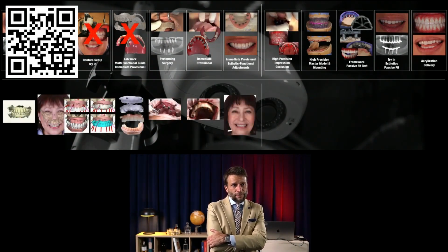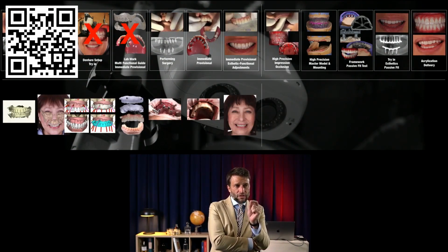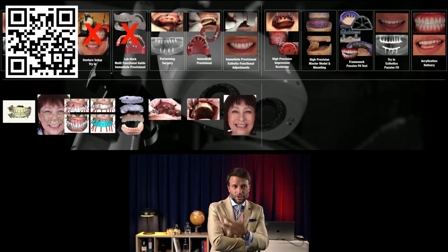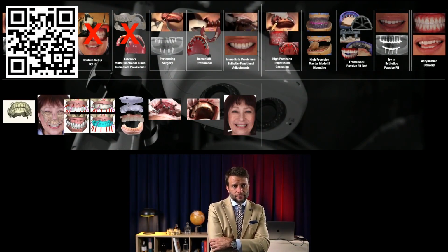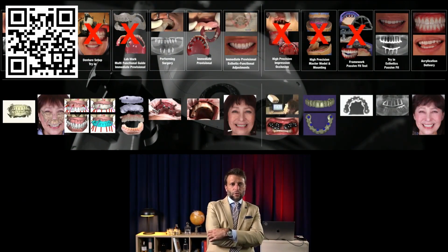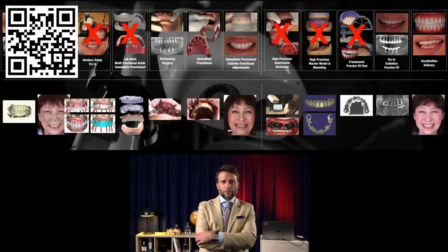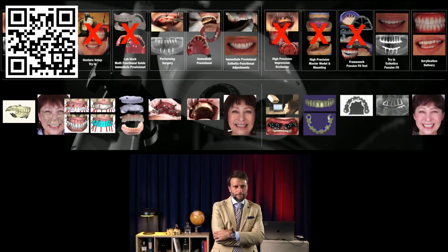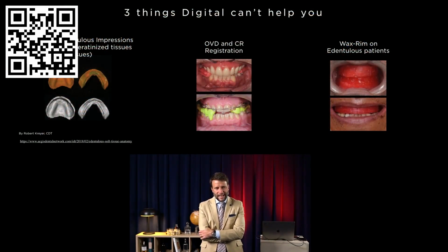And nowadays, with digital, first of all, you just skip. There are certain analog procedures that could bring so much error that they just don't exist anymore. The step just doesn't exist anymore. And all the others are much better controlled. So this is just a quick comparison, and a big shout out to all the doctors that were doing this without technology. Congratulations, you guys were doing magic. Honestly, magic. Not easy. So it's beautiful to work with digital on these cases.